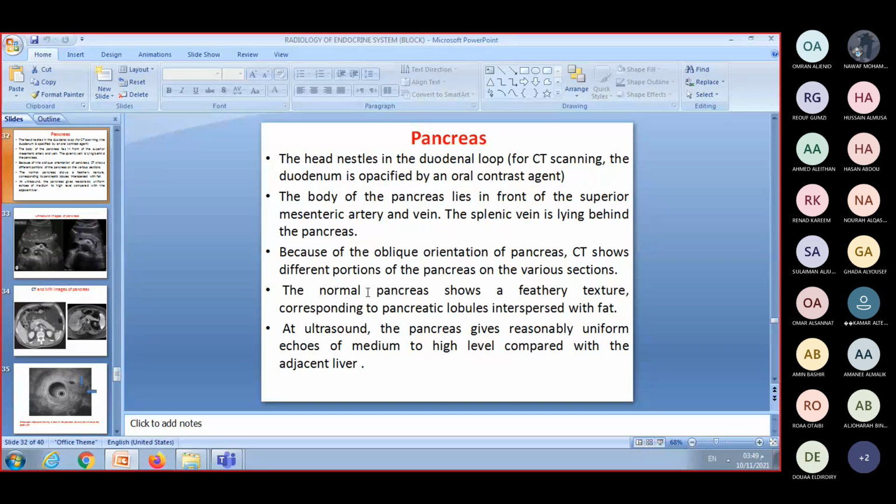If you are interested in the bone, CT is the best to look for erosion or ballooning or enlargement of the pituitary fossa. And what about X-ray then, doctor? If it's only used for the hypophyseal fossa, is it an option, or is it considered obsolete? We just use CT scan now instead.